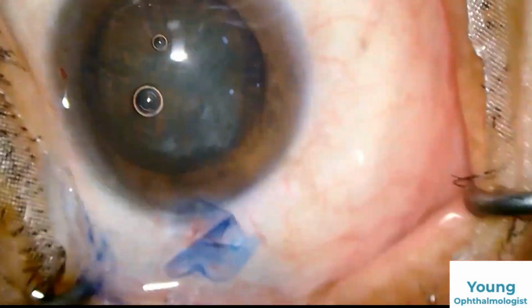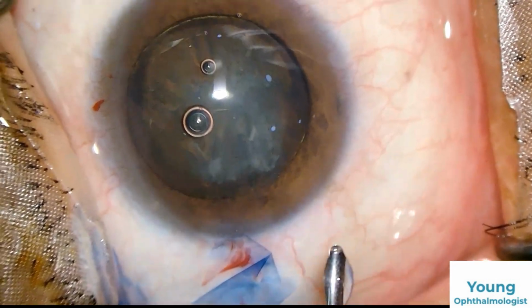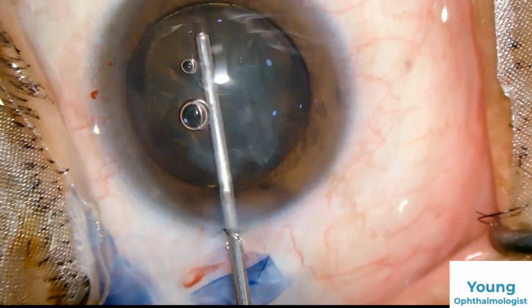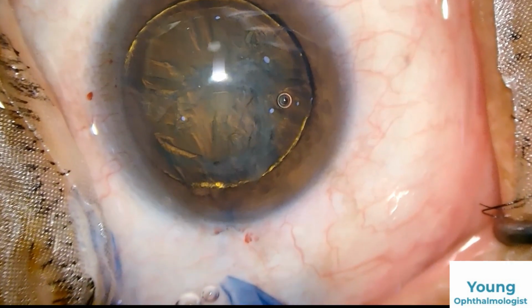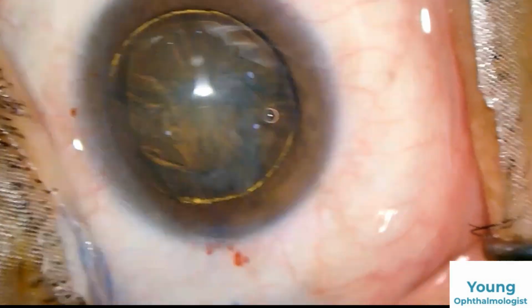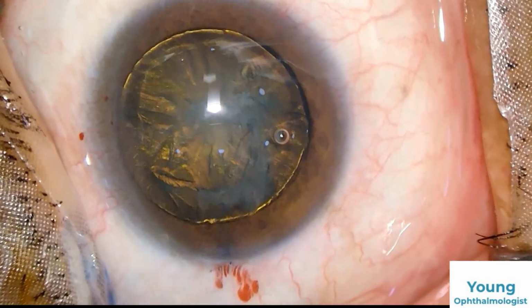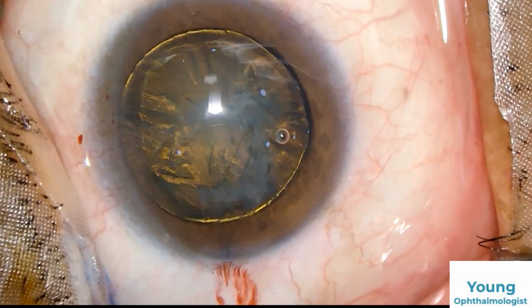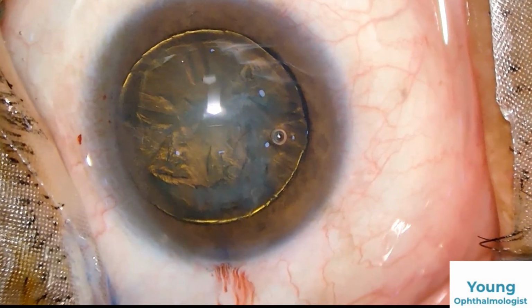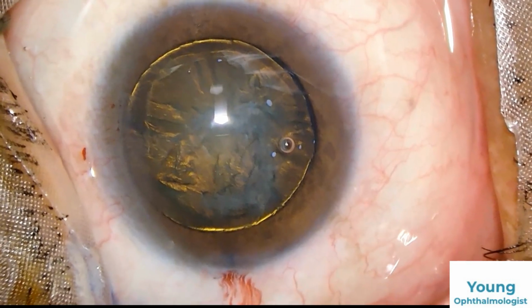You will observe a beautiful golden ring if your hydrodelineation is proper, as you can see here. The patient is constantly instructed to look above the light, and we talk to them, keep them calm, and ask them if there is any pain or stretching they are feeling.